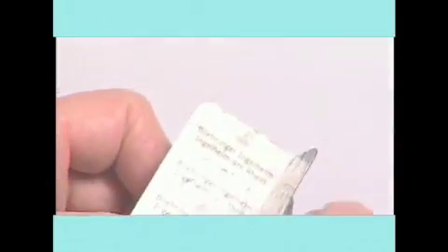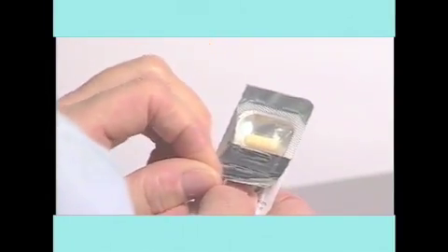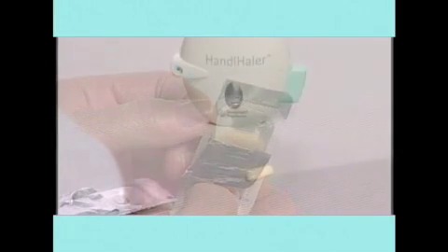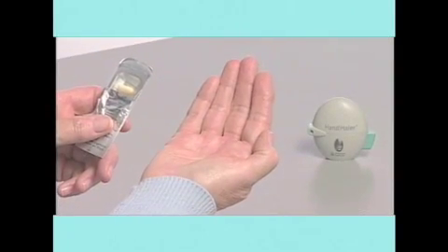Remove the Spiriva capsule from a blister pack right before taking your medication. First, fold and separate the two blister strips by tearing down the middle. Holding the blister strip with the flat side facing up, peel back the foil to expose one capsule. Capsules are sensitive to light and moisture, so be sure to peel back the foil in a way that exposes only one capsule at a time. Holding the blister strip over a table or counter, turn the strip over and let the capsule drop out.